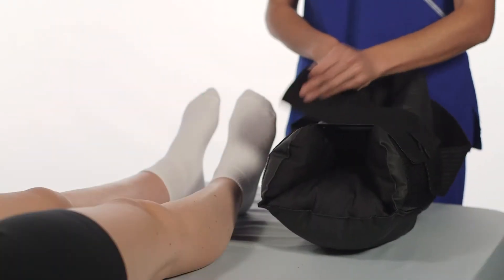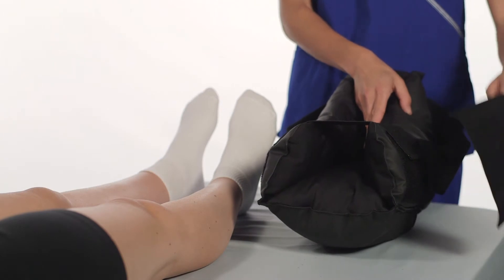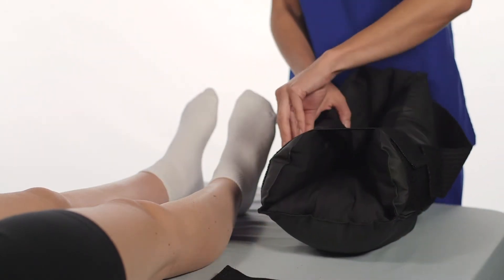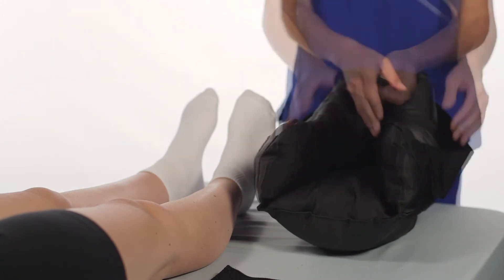To apply the Preventor Heel Off Loading Device, open all strap closures and secure the hook tabs to the loop on either side of the boot.